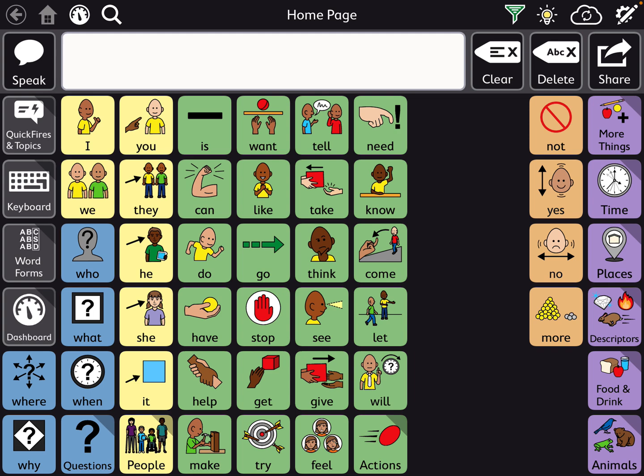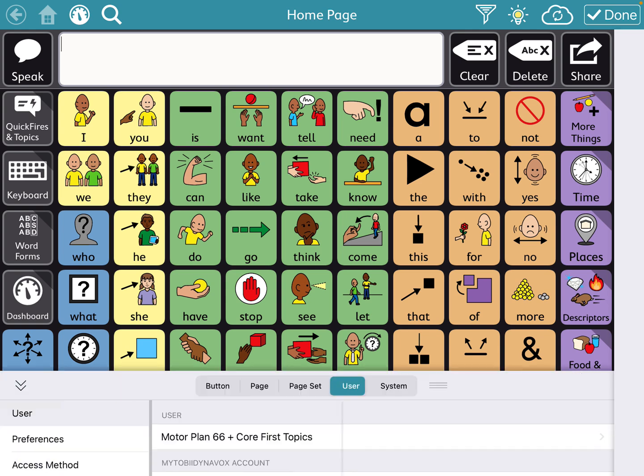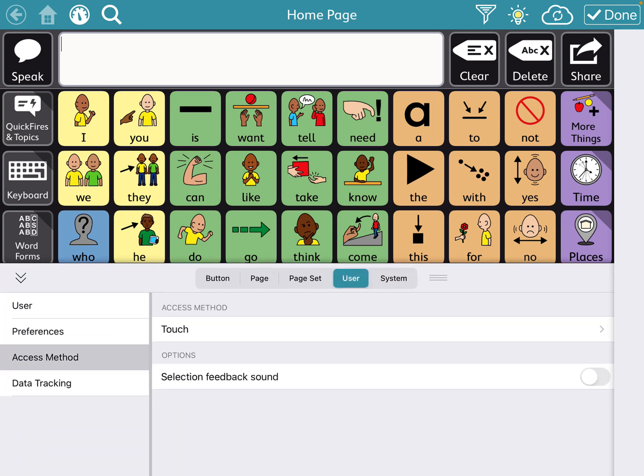You want to go to the top right hand corner of the gear, go to user and access method and you want to look at finding a way so that when they're dragging their finger, it will only activate upon release once they are resting their finger on that item for even like a half a second or so.